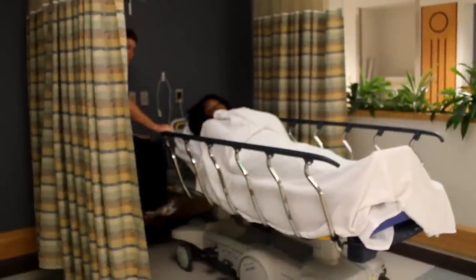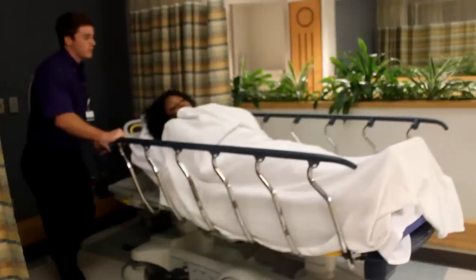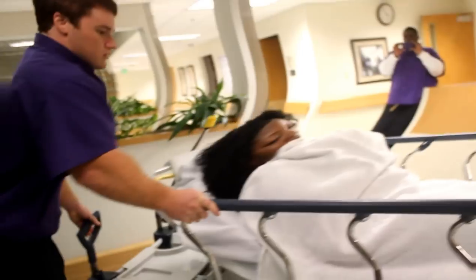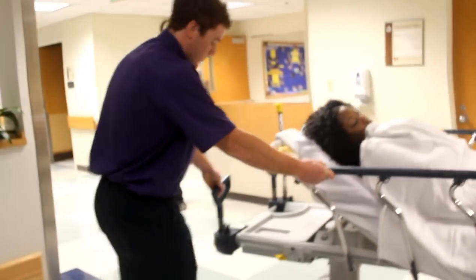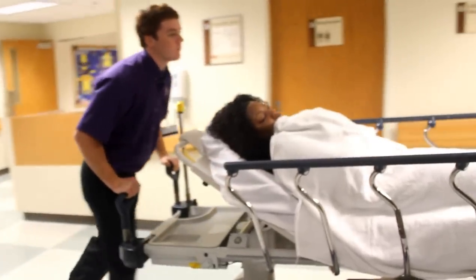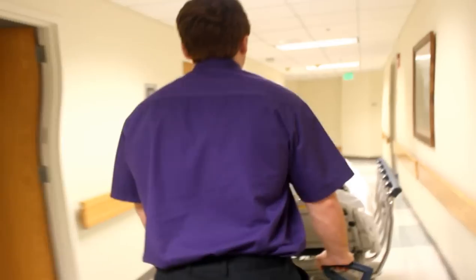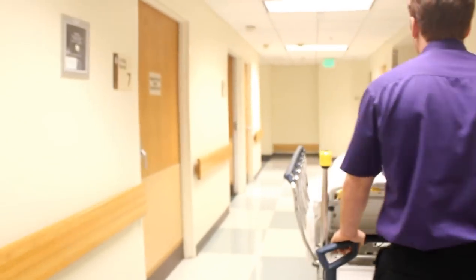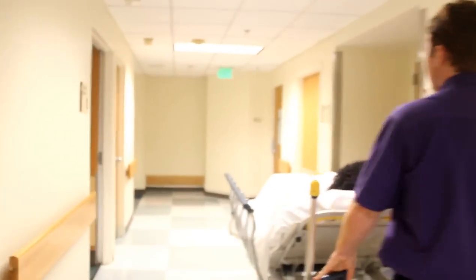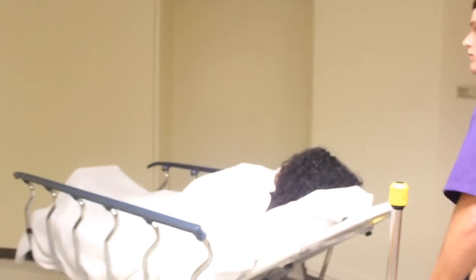We're going to take our brake off and put them in non-steer mode so that you can easily maneuver. Then we're going to put them into steer mode, so we can maneuver more easily around corners through the hallway. We want to make sure we go real slow around corners so we don't run into any oncoming traffic and so that we don't hit any walls.